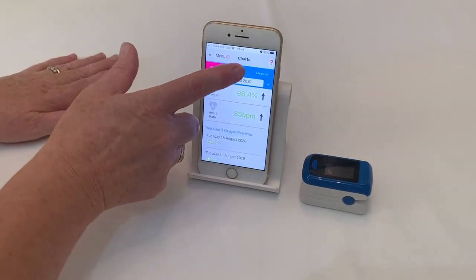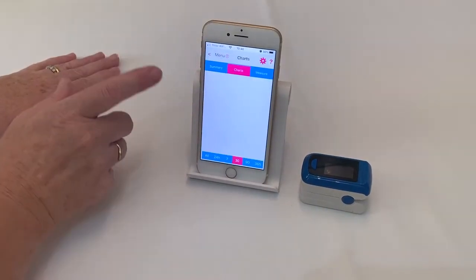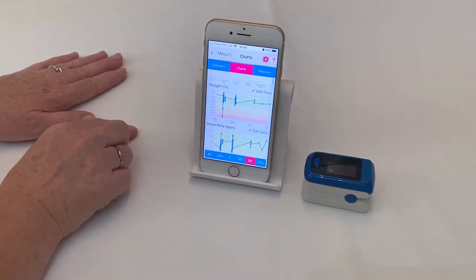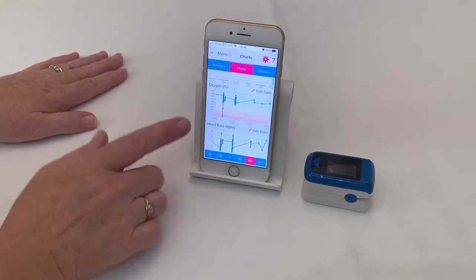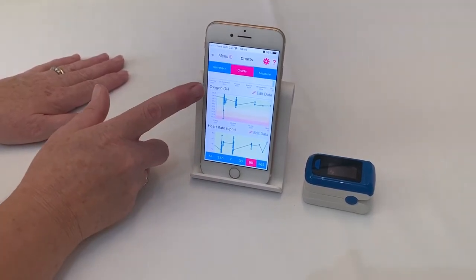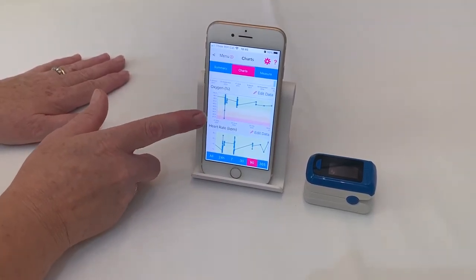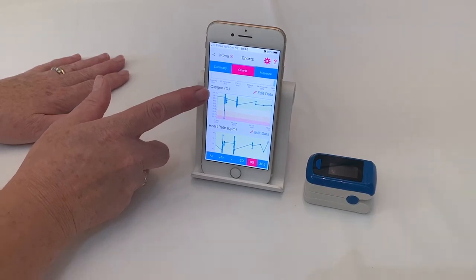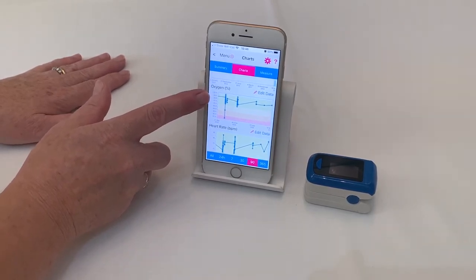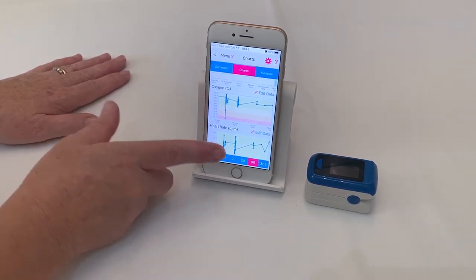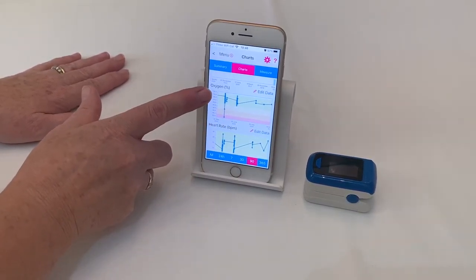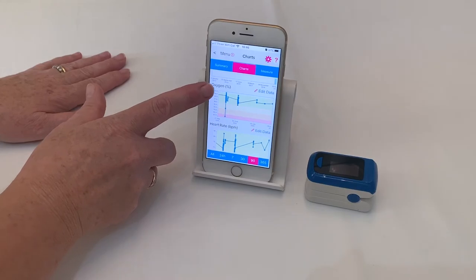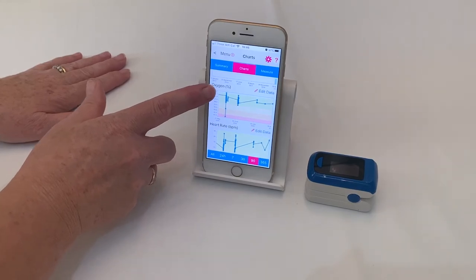To see a graphical representation of your data, press charts and you will see that the data points are in the blue line with green, amber and red behind. The green is normal ranges and red is out of range.